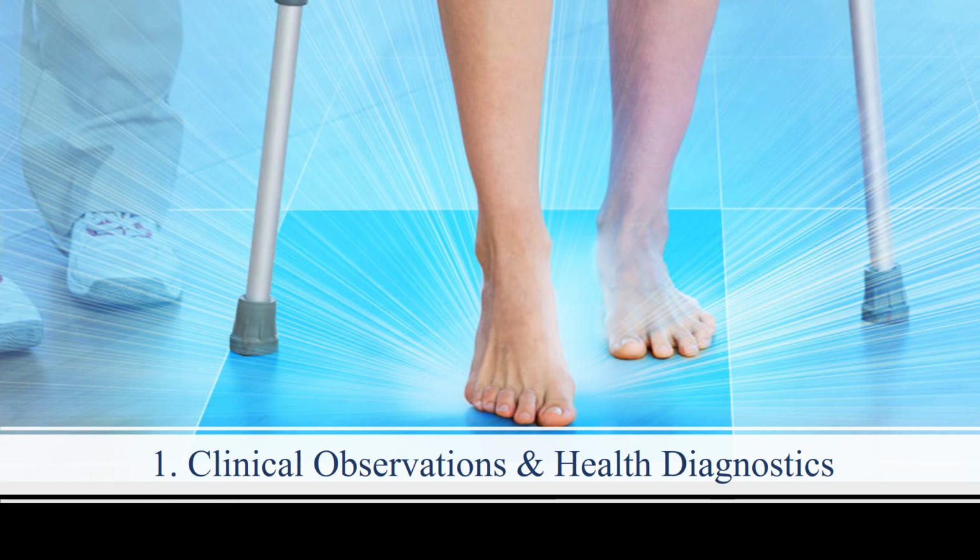The reasons clinical assessment is performed are to document a patient's condition, to diagnose an abnormal gait, or to make clinical decisions. Different types of gait analysis data may be needed for different aspects of the gait assessment. For example, information on foot timing may be useful to identify asymmetries and may indicate problems with balance and stability, whereas the kinematics of limb motion describe abnormal movements.